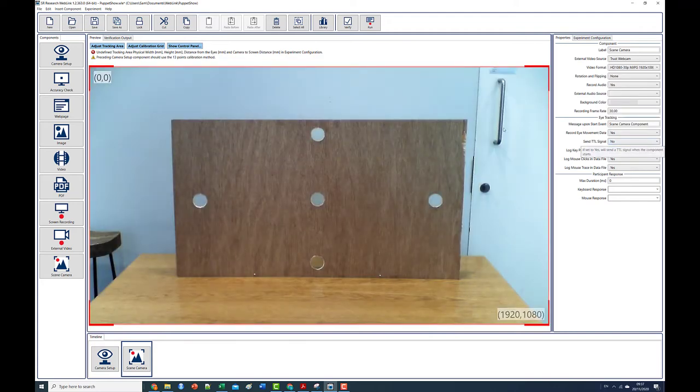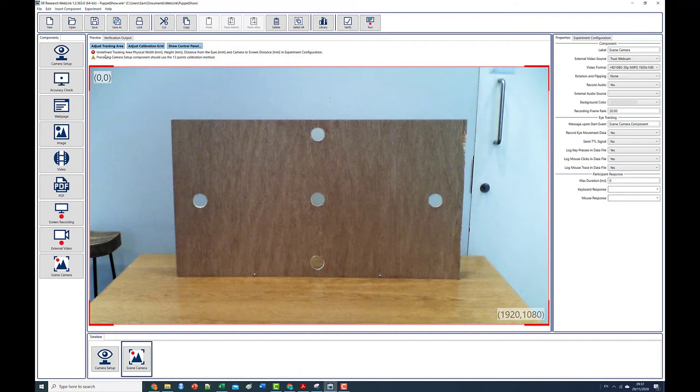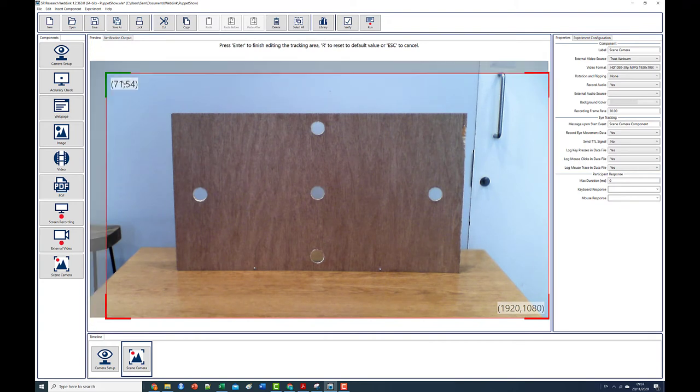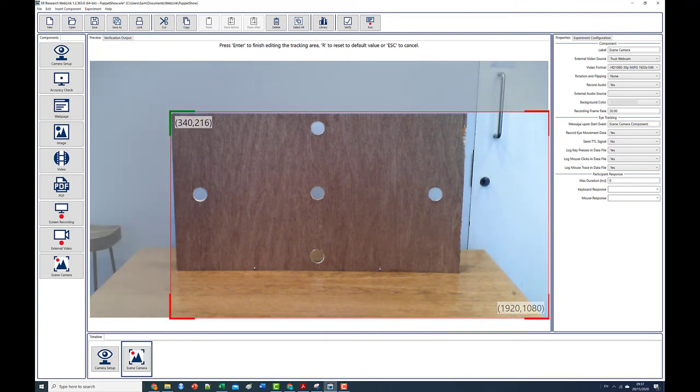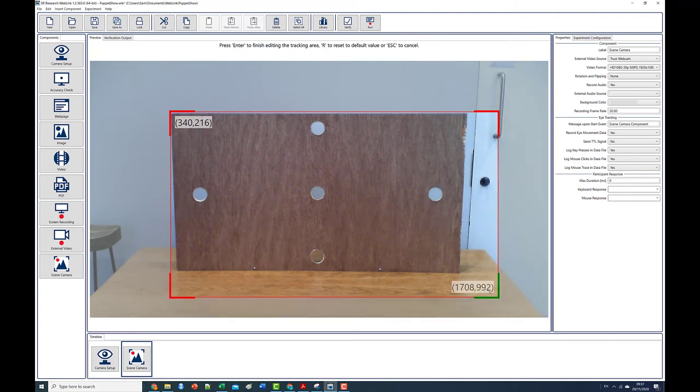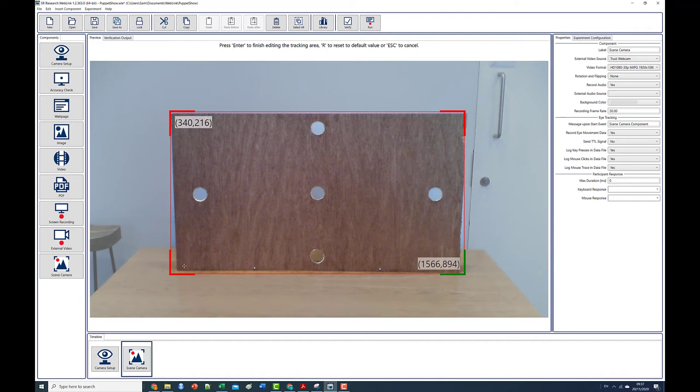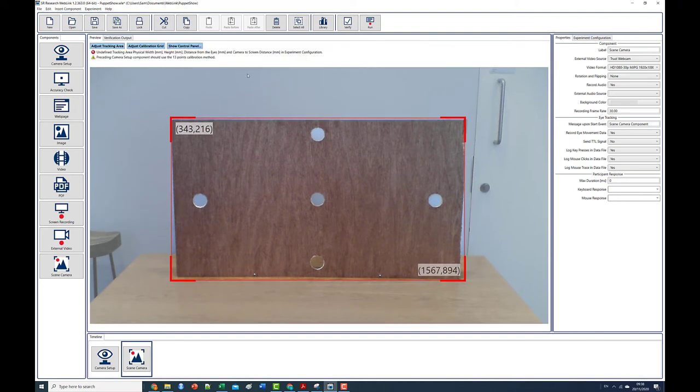The view from the scene camera is unlikely to be a perfect fit with the calibration board. For example the camera may view a larger area. So the first thing we need to do is to define the location of the calibration board within the view from the scene camera. Select the adjust tracking area button in the preview panel and adjust the window appropriately. Press enter when you're done.